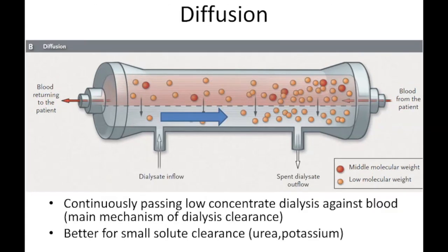This is really the main clearance technique that's used in traditional hemodialysis. And you have about 500,000 people that are getting traditional in the clinic 3 times a week hemodialysis. And this is a little bit different in the sense that blood is still coming through at the same rate. A typical blood flow rate through a cartridge like this for a hemodialysis session might be anywhere from 300 to 500 mLs per minute. So a fairly brisk flow of blood.